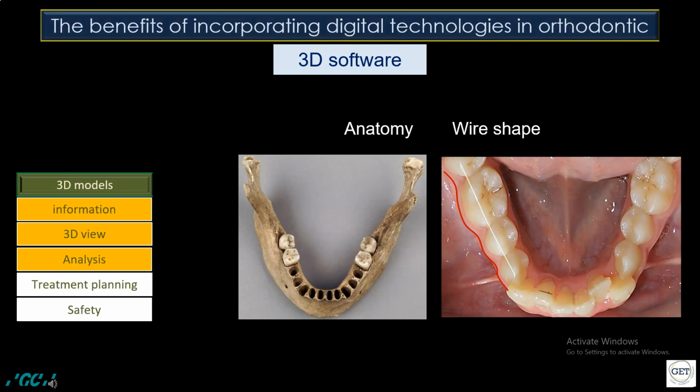A very important feature of the 3D software is the possibility to identify the bony borders of the treated arches, increasing the treatment safety. In some 3D software, a CBCT scan can be imported in the software, allowing to identify the current root position and thickness of the bone and to assist the teeth movement according to the anatomical bone borders. In this way, the operator can choose the correct wire parameter or shape in relation to the correct required teeth position in the bone.